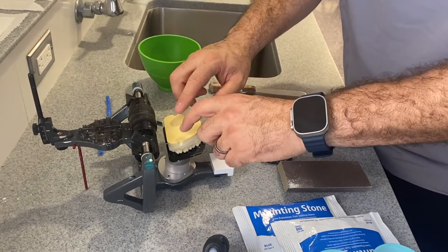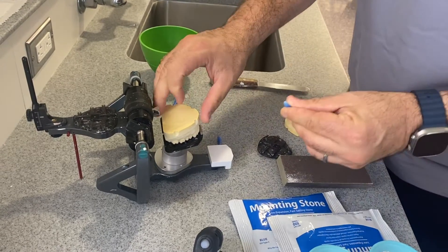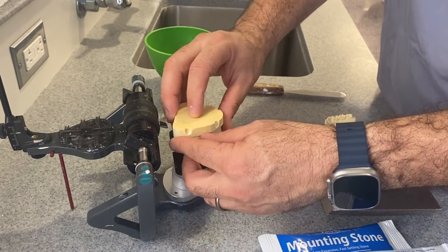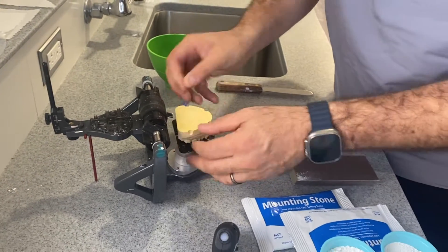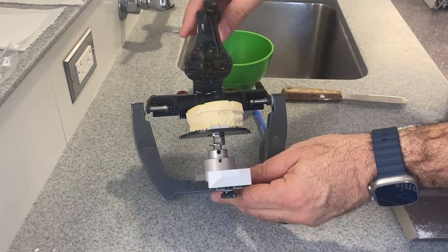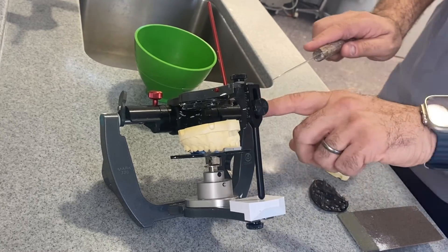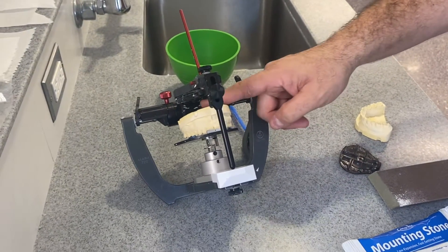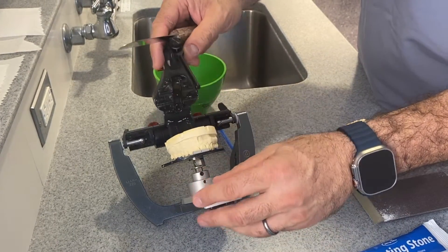Sometimes this part may shift or move, so you can use a little bit of rope wax especially on the posterior section. Make sure the midline is at the midline of the cast. Now we have enough space between the cast and the base plate. If the cast is too thick, make sure you grind it down to where you have about a finger's length. Midline is right there and we're ready to mount the upper.